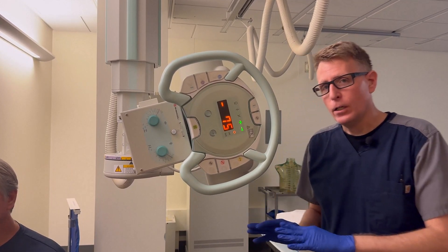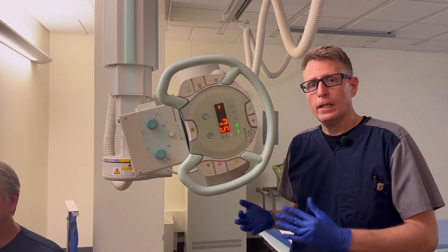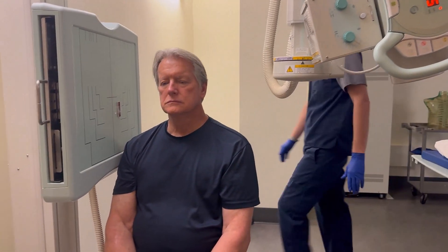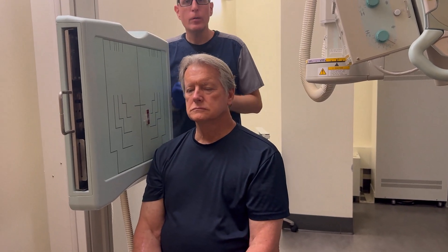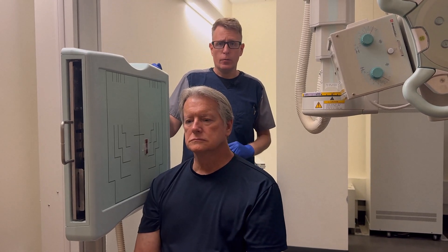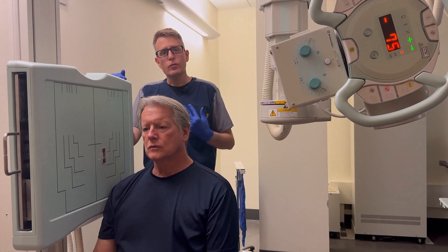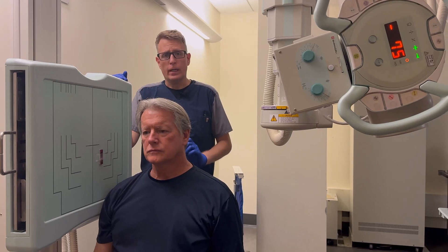I'll show you a method I use — just have the patient rotate and take care of that for you. I'm going to start off positioning with the patient in true lateral position, doing the right side first. You would do these bilaterally and do them open mouth and closed mouth for comparison. I'm going to start out positioning in true lateral. The Law does require rotation, but I'm going to do that at the end.